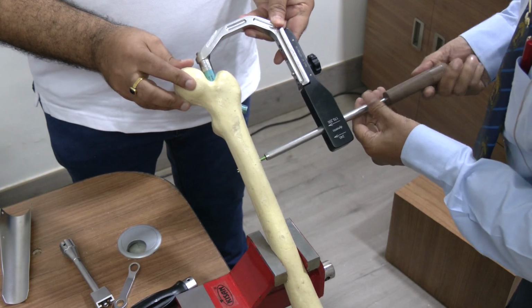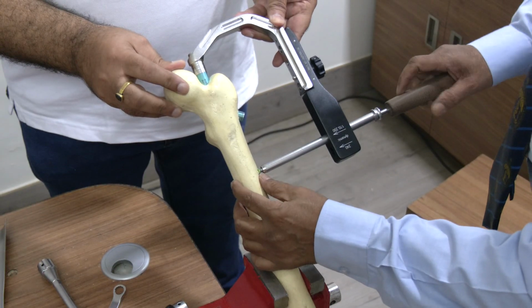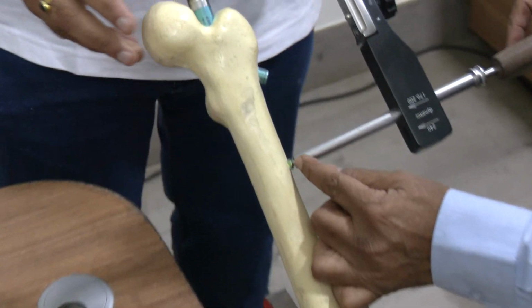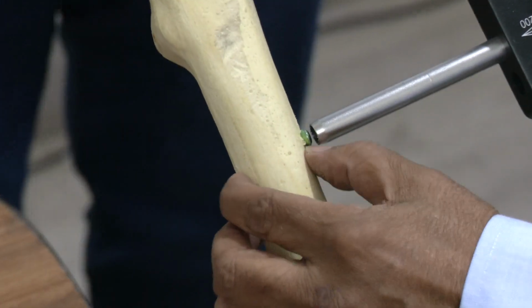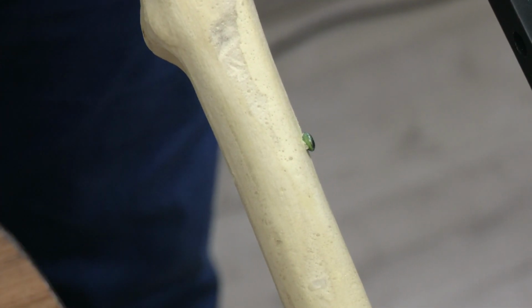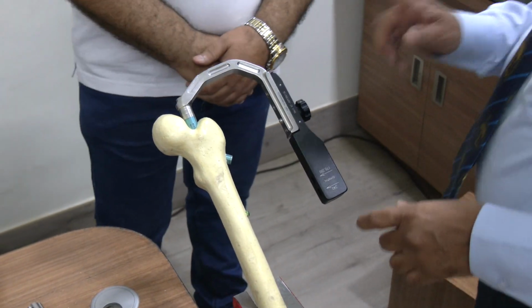So this bolt will be in the lower part of the nail. So always use a bolt which is 2 millimeter outside here, 2 millimeter outside on the opposite side. Here it is a little short. Since I have only one bolt, I am doing that with that only. So this is about the surgery.